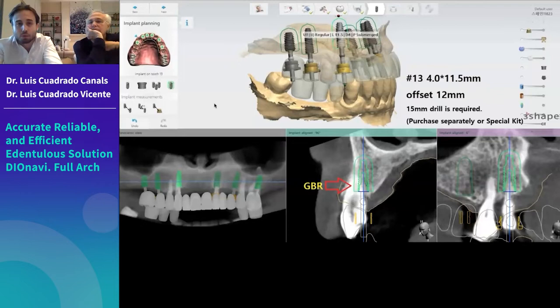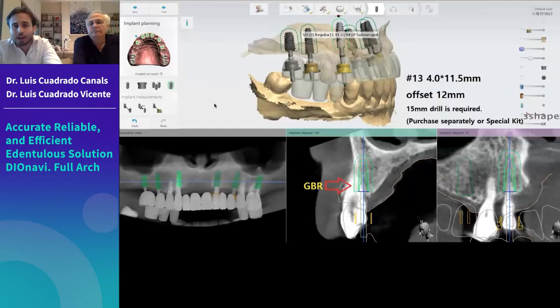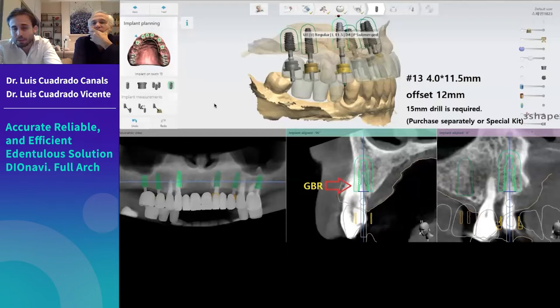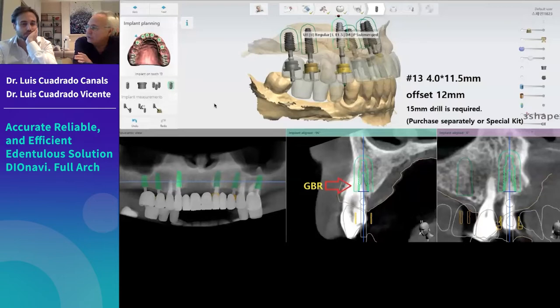The virtual surgical model allows you to practice surgery before the patient arrives, letting you see the type of bone and determine if under-preparation is needed. You can modify the plan if needed. The special multi-unit abutments DIO designed for full arch are longer than standard ones, providing better stability between the prosthesis and abutments.